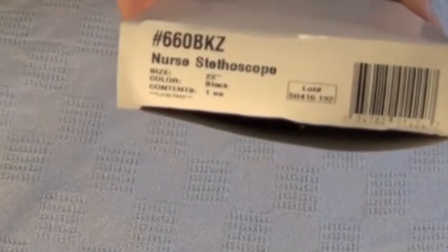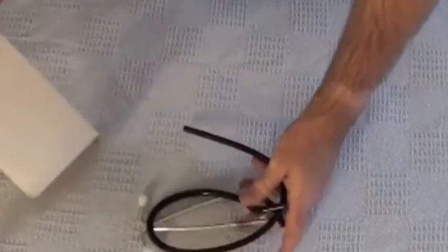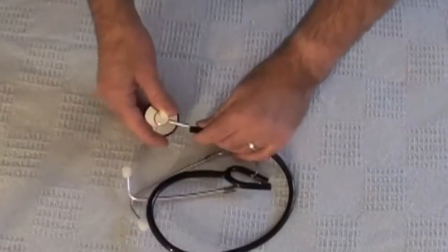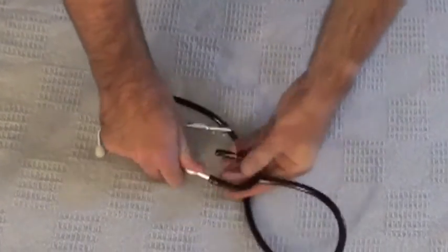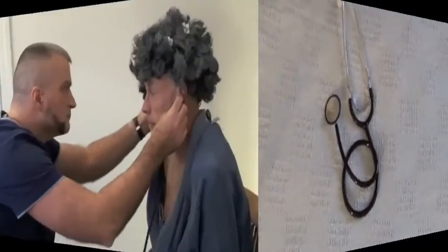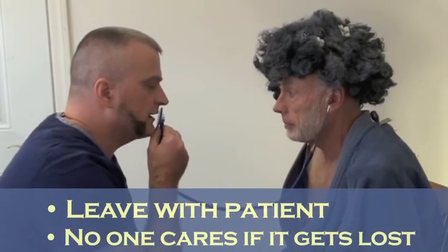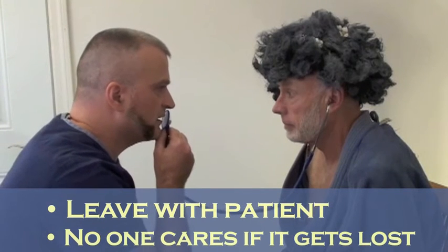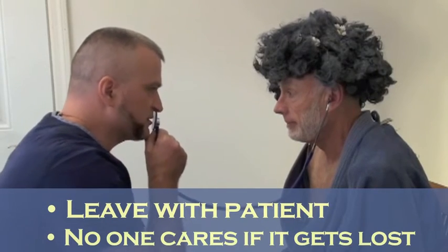One solution is to see if your department has what I call a MRSA stethoscope. These are those super cheapo, crappy, disposable stethoscopes that are meant to be kept in the infection control cart. They're very inexpensive, and if you find one of these, you can assemble it and put the earpieces in the patient's ears and talk with your mouth right up against the diaphragm. The good thing about this is that you can let the patient keep the stethoscope wherever they go so everyone else can talk to them through it. And if it gets lost or misplaced, you haven't lost a valuable piece of your own equipment that you need for everything else you do in the ER.